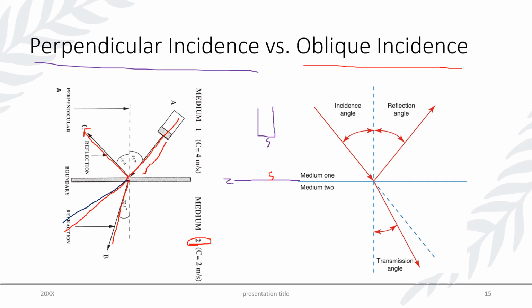Most of the time, this doesn't affect our imaging too greatly. One thing that it does do is it can cause some mirror imaging artifacts to occur once in a while, and that's something we can touch on a little bit later. But just the idea: perpendicular incidence is going to give you the best, strongest reflection. Oblique, you're going to lose some of that reflection to scatter, and so always, if possible, shoot for perpendicular incidence.